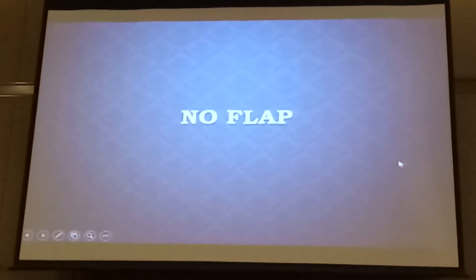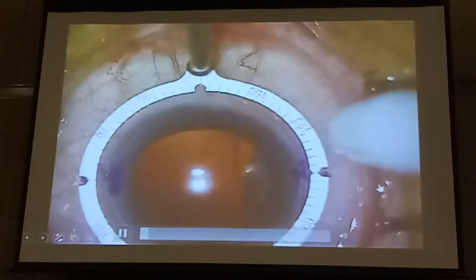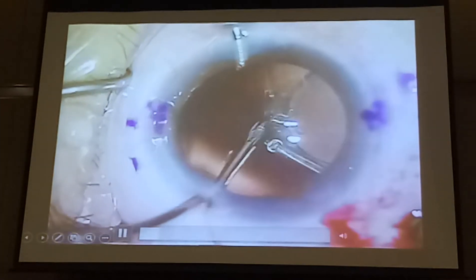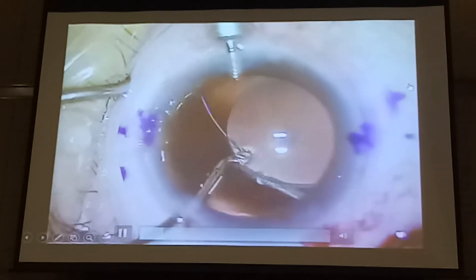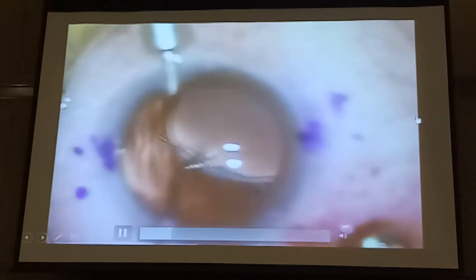Then we move to no flaps. People say it took so long, it's invasive, you'll dissect the conjunctiva, patient gets glaucoma. So this is the Yamani technique: mark diametrically opposite positions, no conjunctival dissection, 2mm posterior, 2mm away. So I'm grasping the IOL — the lens for exchange — and I'm going to reuse this lens. Very carefully, remove all capsular remnants and vitreous so that you can do these gymnastics in the eye.